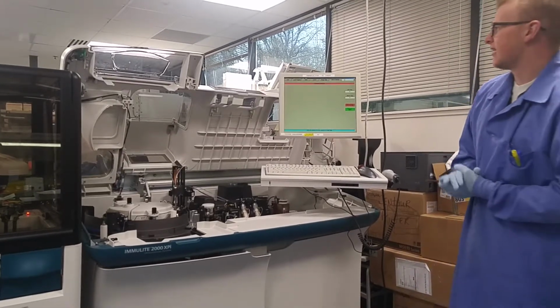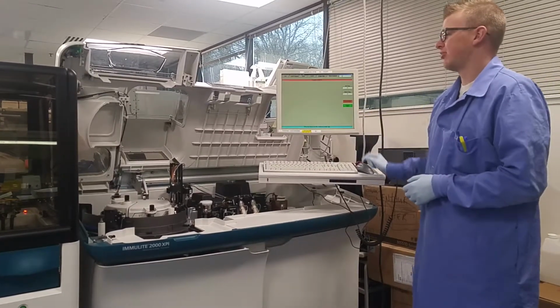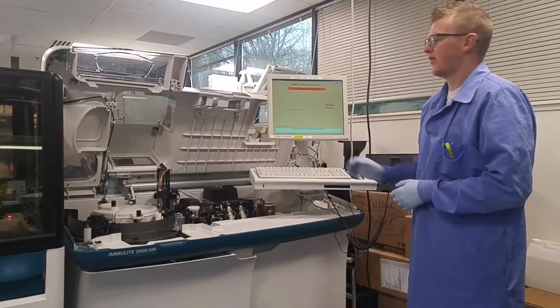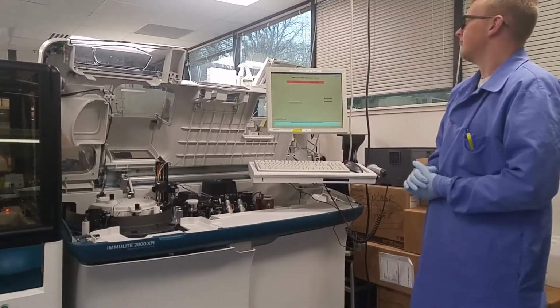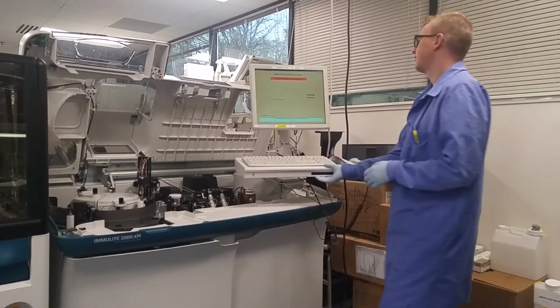Next message states that the probe dispense is passed. It's now saying program completed. So we're going to go ahead and exit and quit out of the diagnostics main menu. At this point, you can go ahead and close the cover on the analyzer.